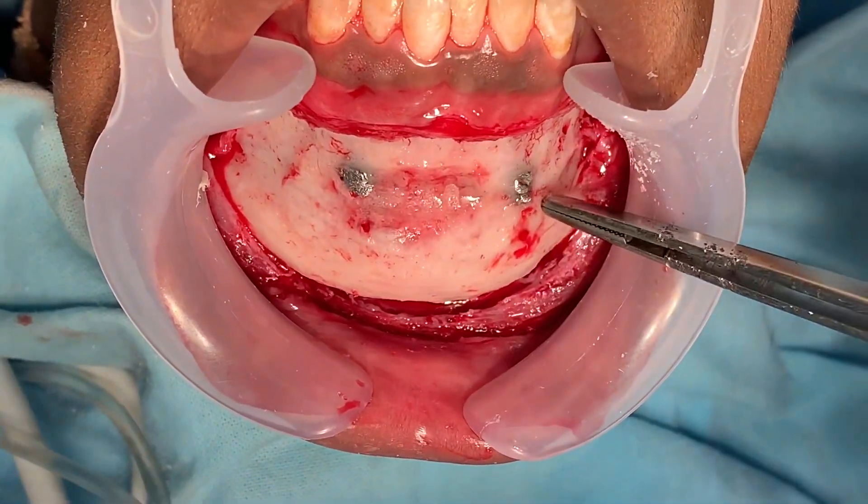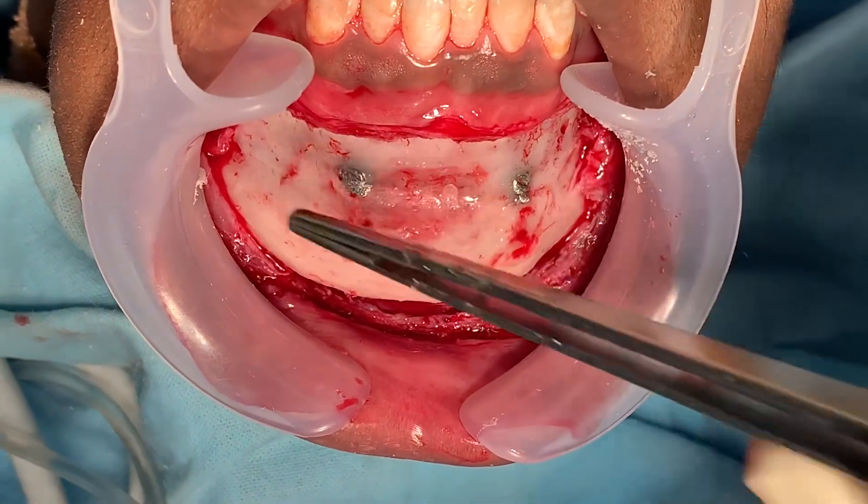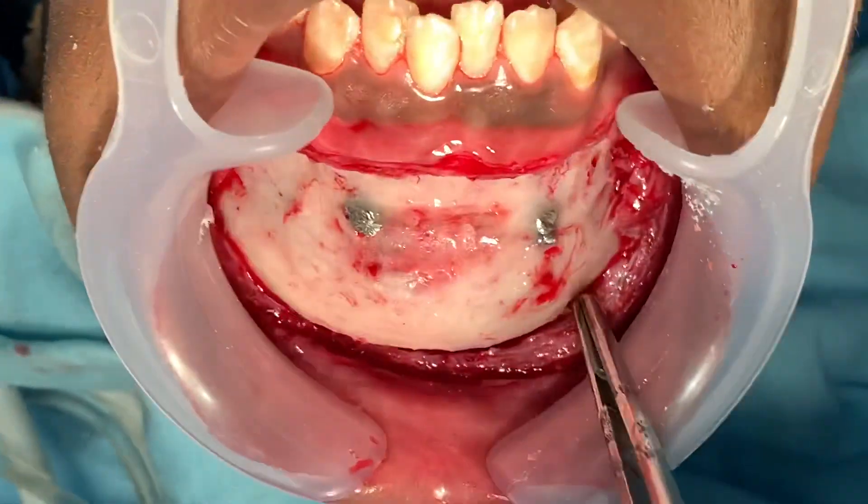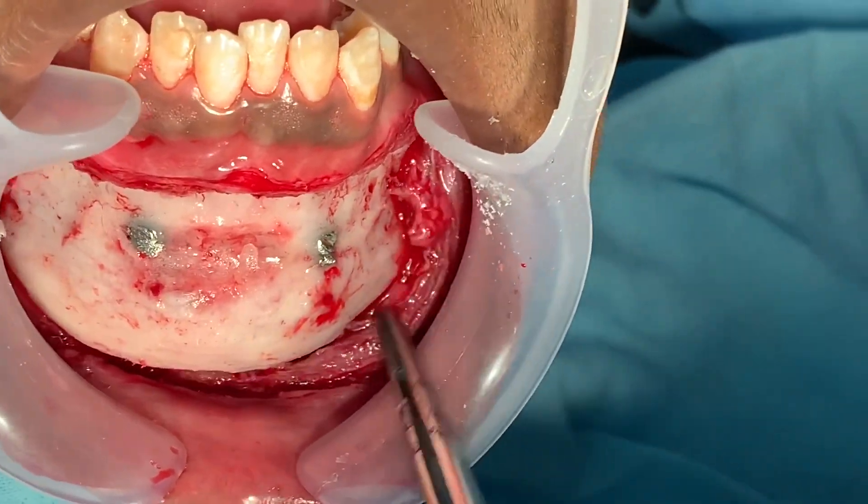These two things that you see are implants from the earlier osteoplasty, the earlier genioplasty that was done. You can see the mental nerve on both sides — albeit a bit thin, but the mental nerve is intact.